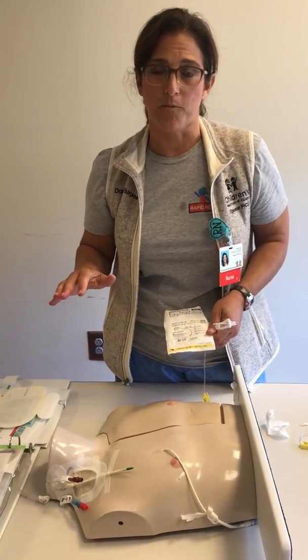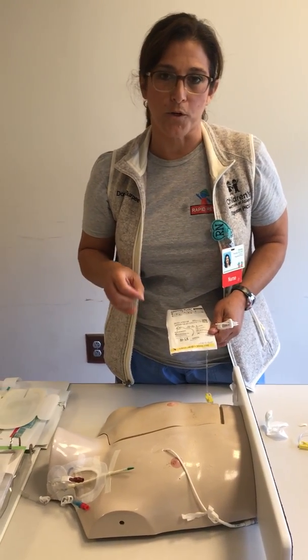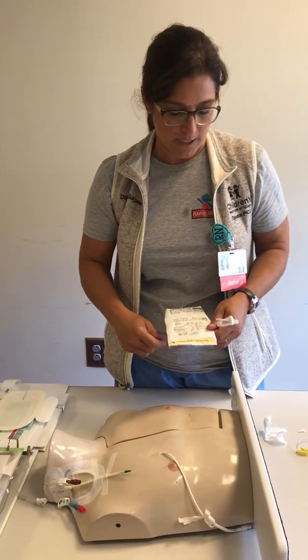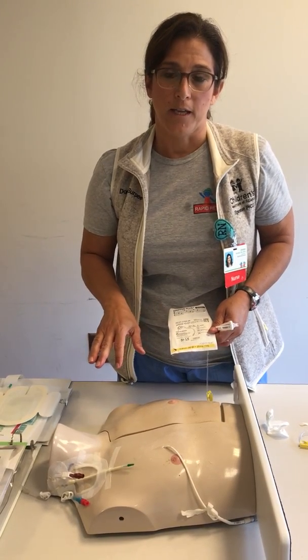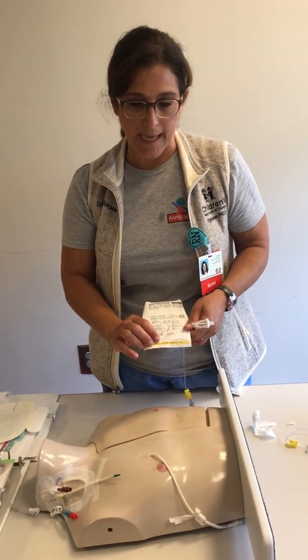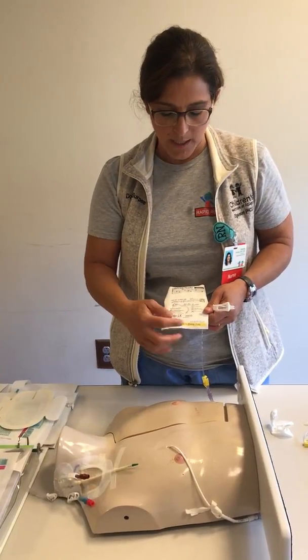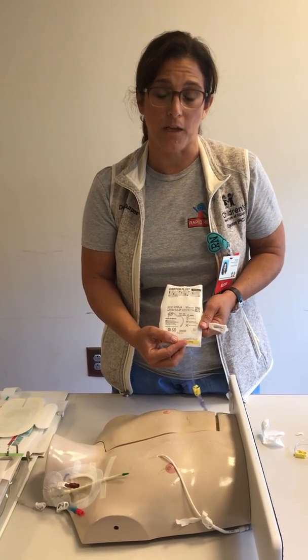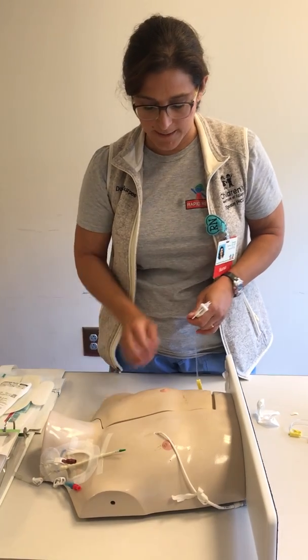Sometimes these kids come up from the ED and they'll have a 22 gauge in. If you know they're going to need a lot of blood draws, a lot of infusions, a lot of fluids, it's better to change the needle then. If you don't think they're going to need that, you can leave the 22 in. But if you're accessing a new port, try to get a 19 or 20 gauge. That's mostly what we carry anyway. What's important for us is knowing the length of the needle. You can get that from the parents or from the chart, and that's real important for accessing.